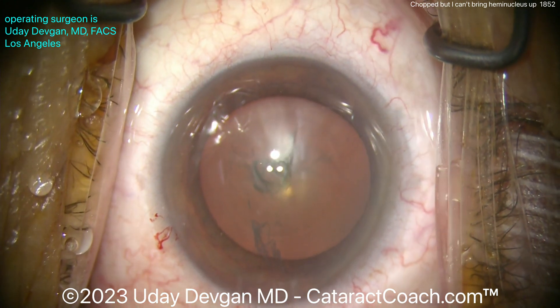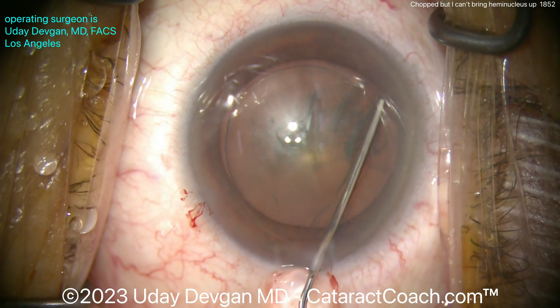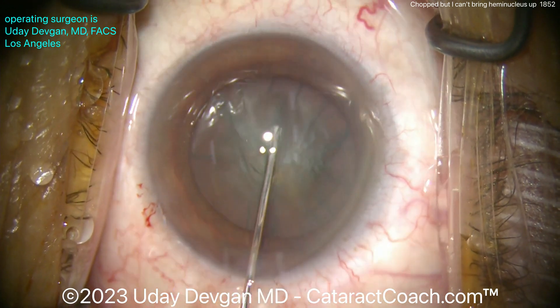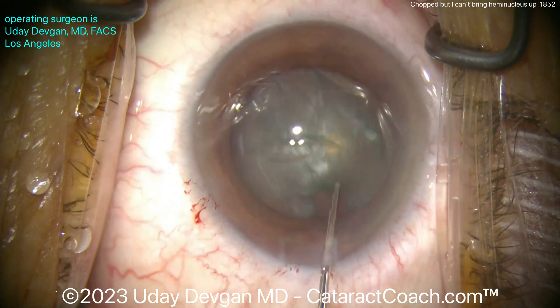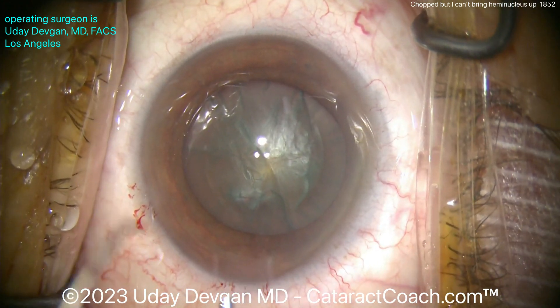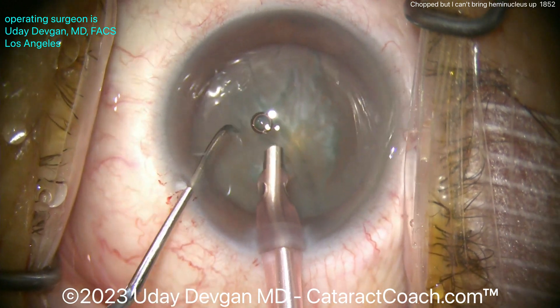Here comes the hydrodissection — again, this is not the issue, because you'll see it's good hydrodissection. This fluid wave, another fluid wave, looks pretty good. Look how you lose viscoelastic from the main incision. Let's tap down the nucleus — does it spin? If it does not spin, you will not win. But this is definitely spinning; we like it. Now going with the phaco probe bevel down — watch carefully, here comes the chop.